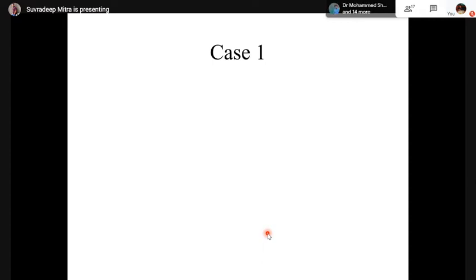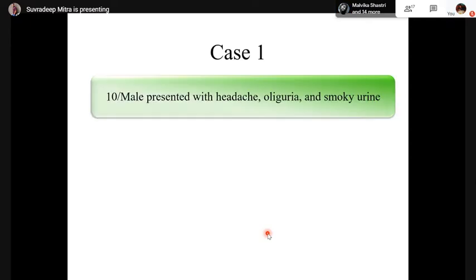So at the beginning, DPGN, MPGN, I mean diffuse proliferative glomerulonephritis, mesangioproliferative glomerulonephritis, membranoproliferative glomerulonephritis, they are not really disease entities, they are just the patterns. But from the pattern, we can deduce what disease is actually causing this particular pattern. So with that, case 1.